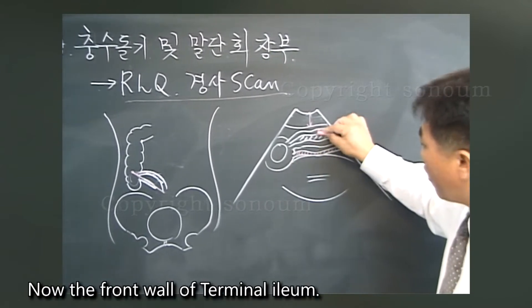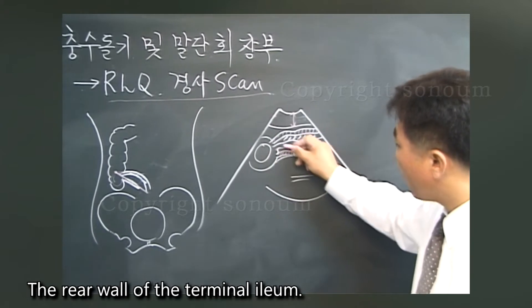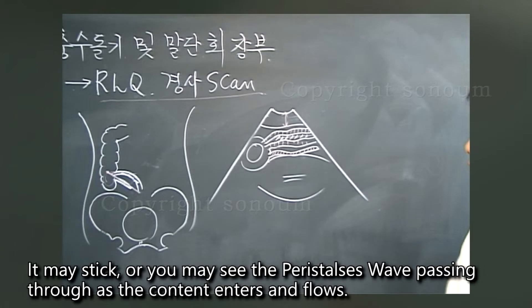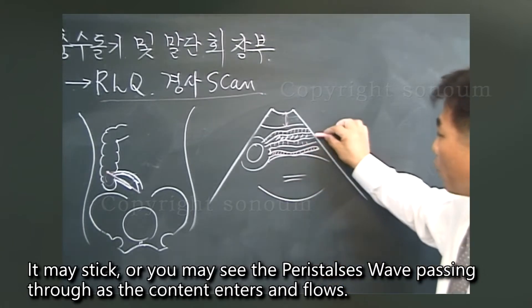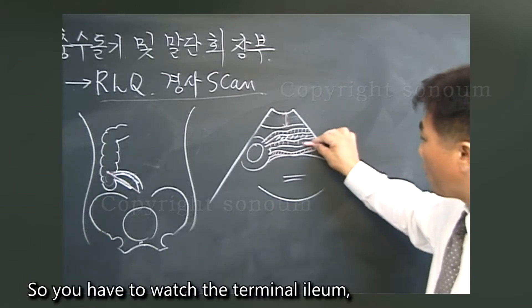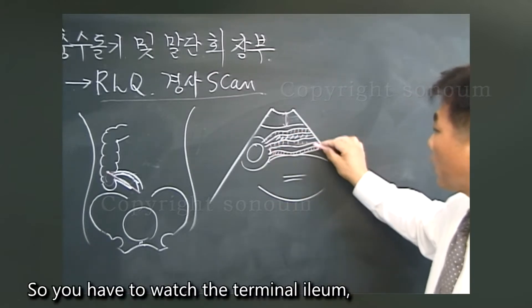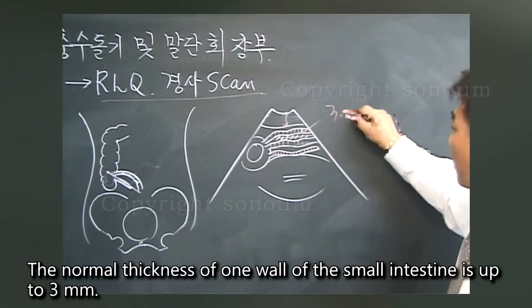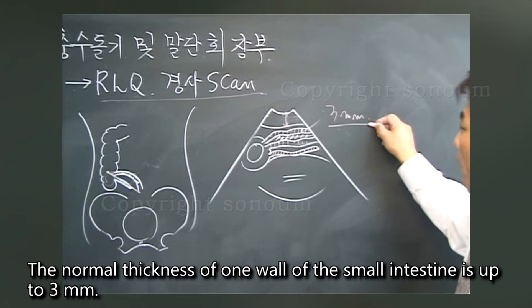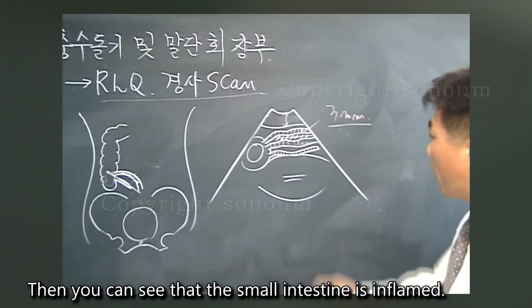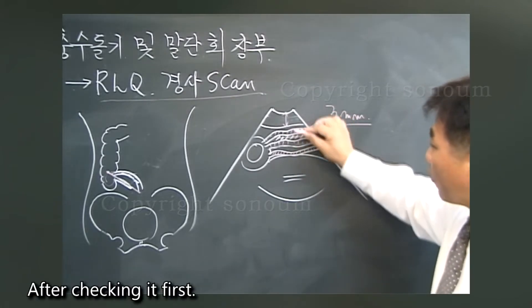The front wall and rear wall of the terminal ileum are visible, with the shaded part in the middle being the lumen. You may see peristalsis waves passing through as content flows. The normal thickness of one wall of the small intestine is up to three millimeters; if it exceeds three millimeters, it can be called inflammation.